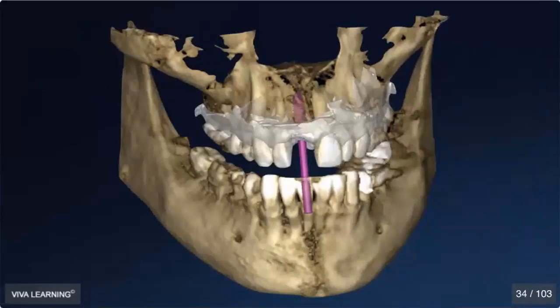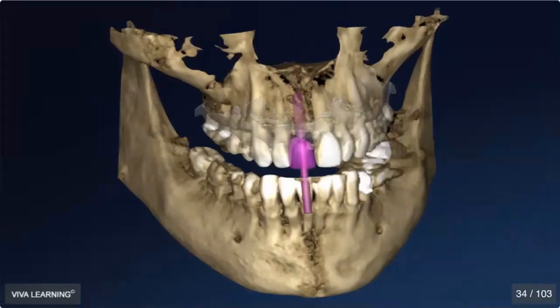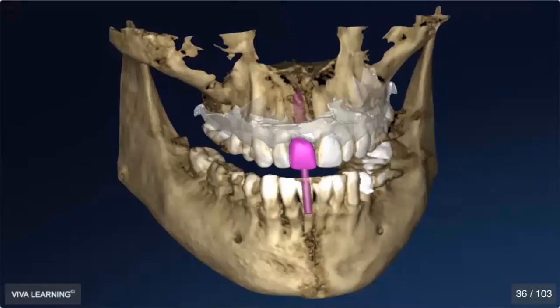Here we go. We have a CBCT scan and we have the intraoral scan overlay. Even with this information, it still may not be enough to effectively have an idea, especially of implant depth and even emergence from a labial and palatal angulation position. We really do need a wax-up in space that has all of those shapes and sizes and positions built in so that we can position our implant off of that. So having all of that in combination is very important, I find, especially for these difficult to pull off anterior aesthetic cases.